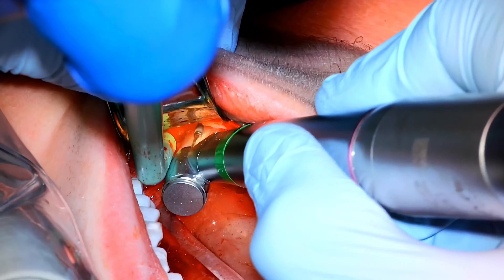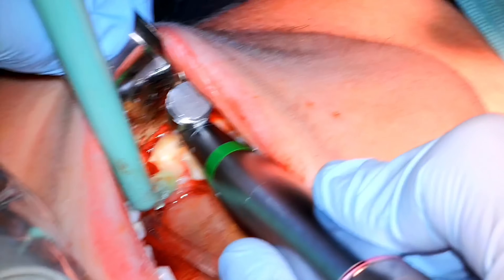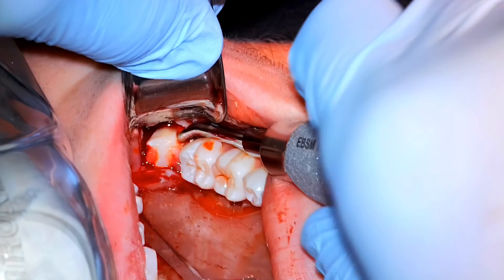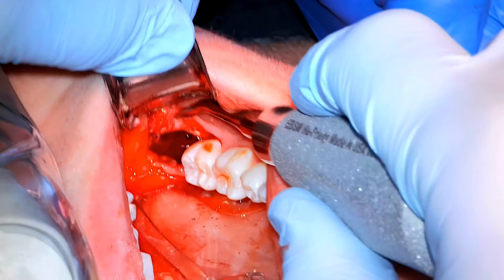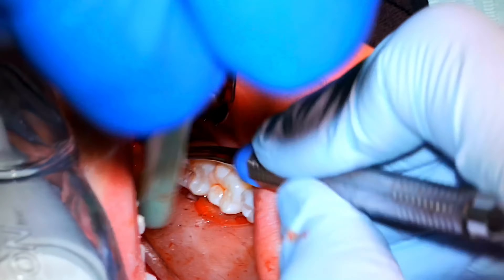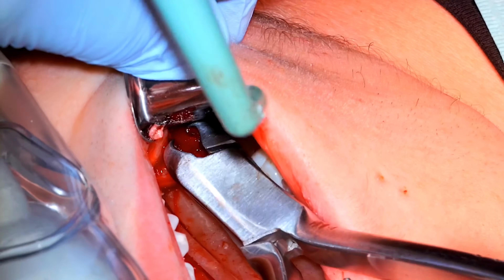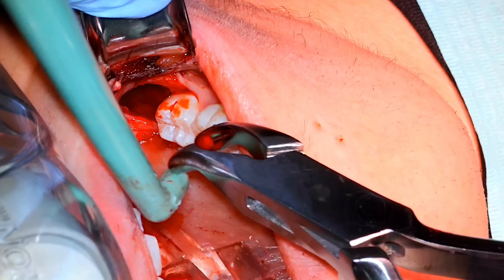It looks way better when you get that distal root out cleanly, but this is reality — sometimes you just don't quite get the right mark. So going back, I'm cutting a little bit along the buccal, then punching a purchase point into the tooth with the 703 bur. I put a Cogswell B into that purchase point — leave it off the bony shelf — and it just kind of pops the tooth out, giving me a bit of a handle to lift the tooth out. That's a good trick if you're ever having trouble delivering a tooth. Then here we're just cleaning a little bit within the socket, which you should always do especially after drilling.